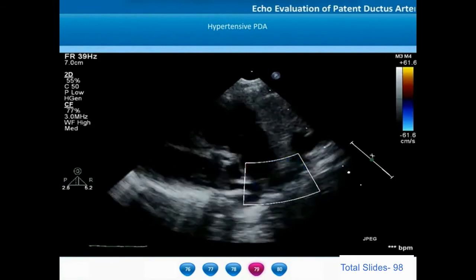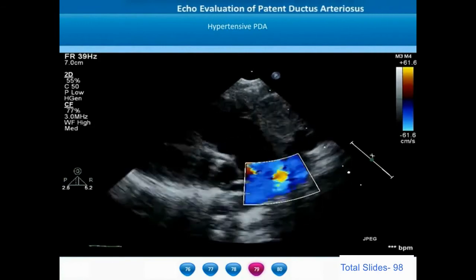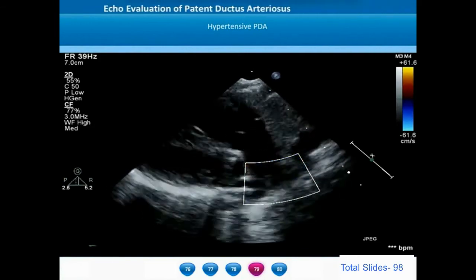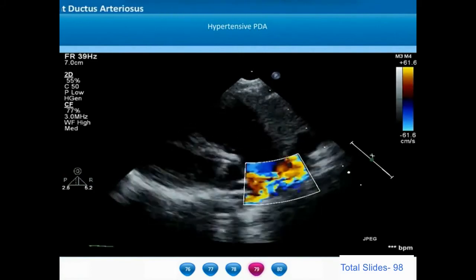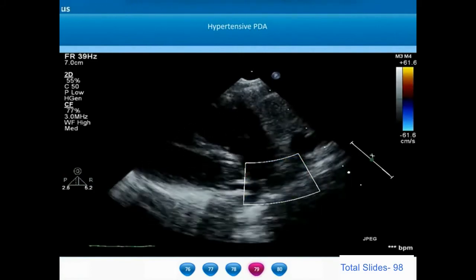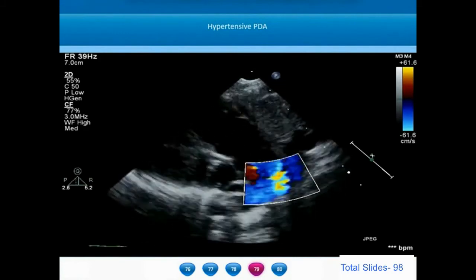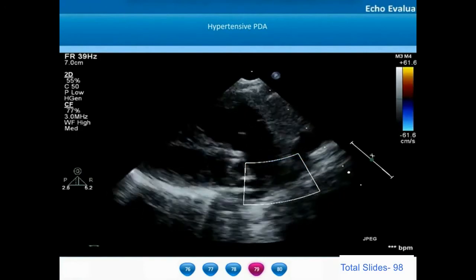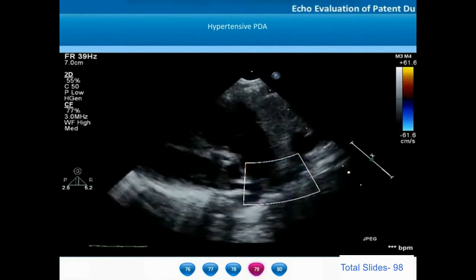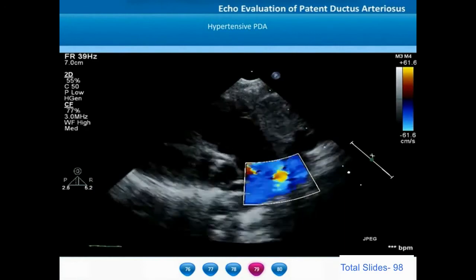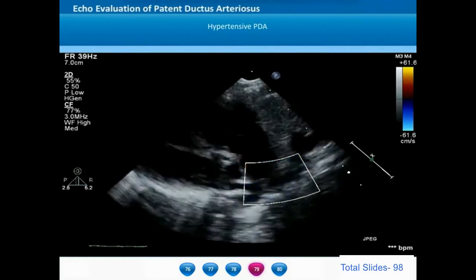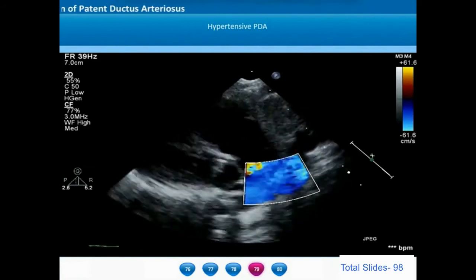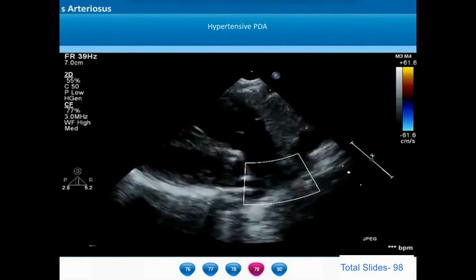We now move on to demonstration of a typical hypertensive PDA. On the left parasternal ductal view, the right ventricular outflow tract, the pulmonary valve, and the dilated main pulmonary artery are shown. A ductus arteriosus communicates to the descending thoracic aorta, and the flow in the PDA is entirely right-to-left — a feature of hypertensive PDA.